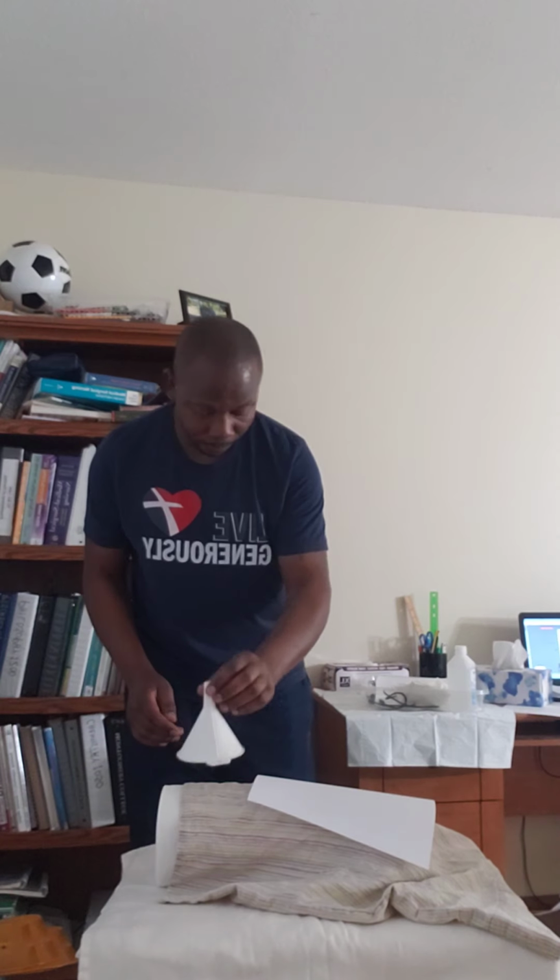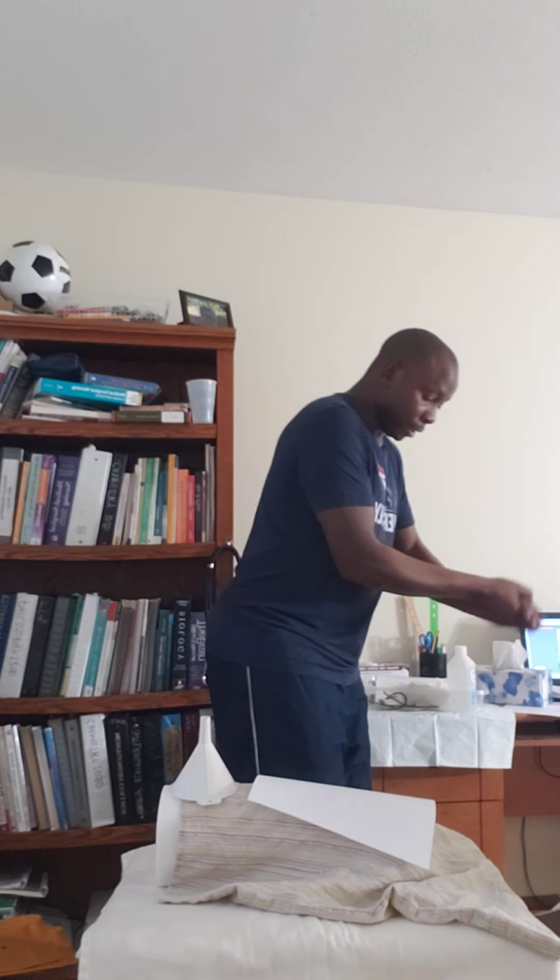I have to put something on the chest here to protect my patient, maybe a barrier. And remember, this is a tracheostomy. Okay, so now I'm doing that one.